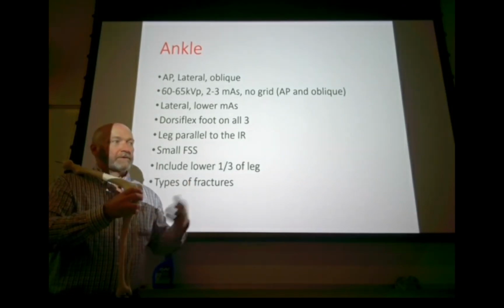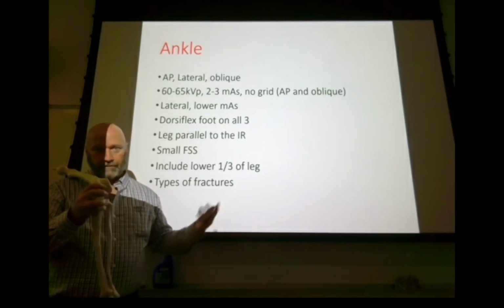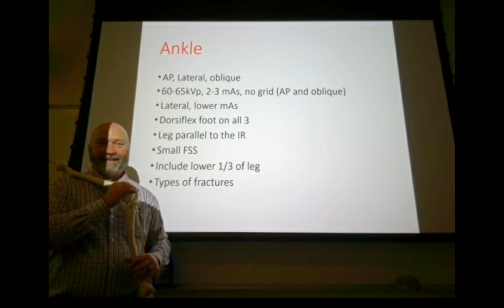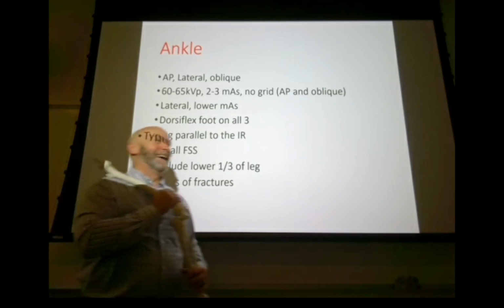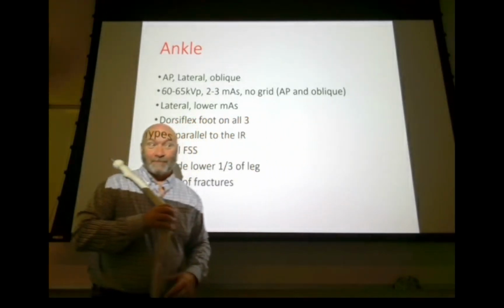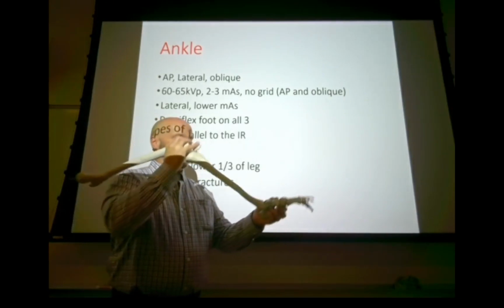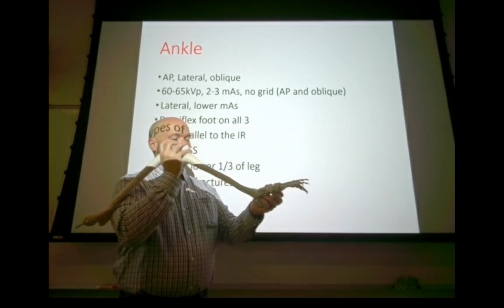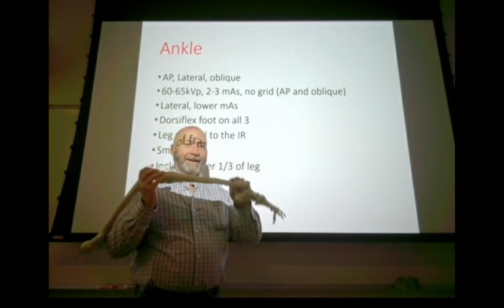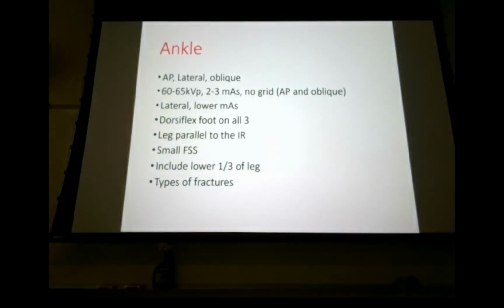All right, so talk to the ER doc, ask him if you can just shoot a leg, because you're going to have to bring him back and shoot it anyway. What's better? Put it down and walk away like you didn't do it. Yeah, somebody else does that. Yeah, it's creepy. I tell you, you pick it up, and the foot's kind of like that, and you pick it up, and the foot just goes flop, and it's flat-footed while you've got the leg up here. It's creepy. But just go ahead and set it down.